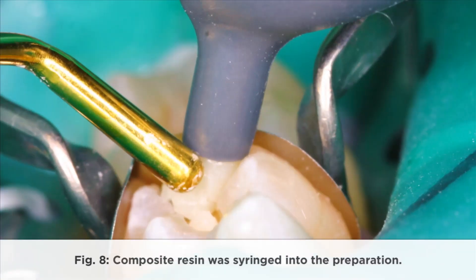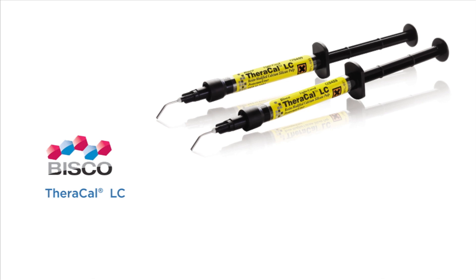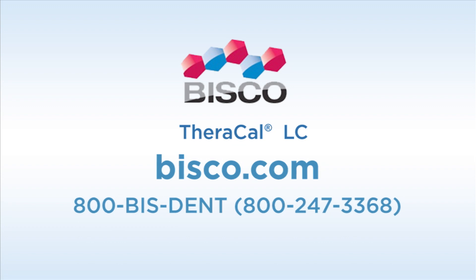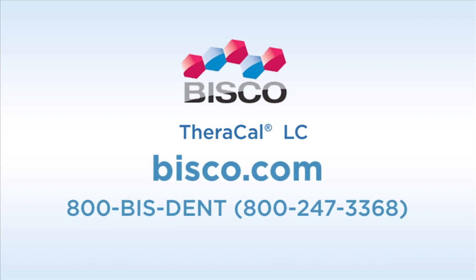Composite resin was syringed into the preparation. For further information on Bisco, visit Bisco.com or call 800-BIS-DENT, or visit DentalProductsReport.com.